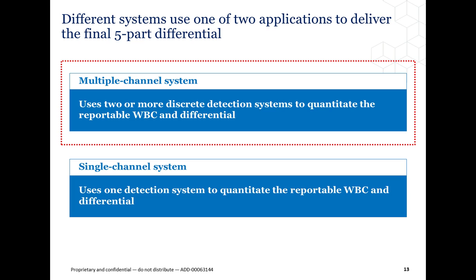Okay, I'd like to now transition over and discuss how contemporary hematology analyzers use various technologies and methods to determine the 5-part or greater automated differential. So let's consider 2 primary approaches. The first we will call a multi-channel system.